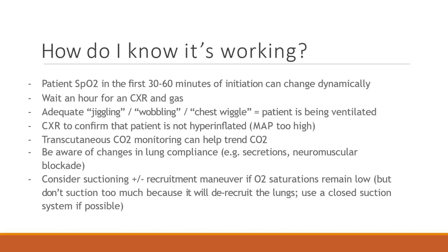I don't mean adjust it as far as putting it in and out, like retaping it, any of that. It's just sometimes because they're so small, the ET tubes are so small, that increases the resistance so much that the angle is very important, that they're not doing any kind of weird angles, that it's a nice mellow arch, that we trim our ET tubes.